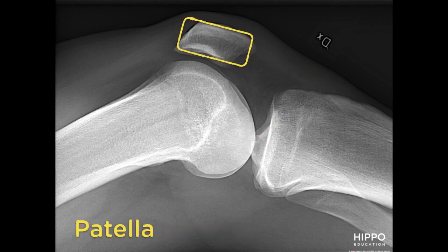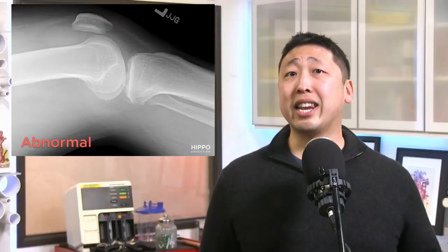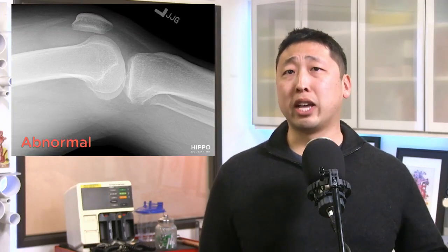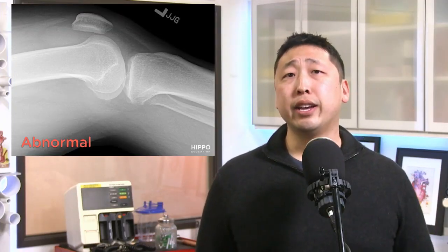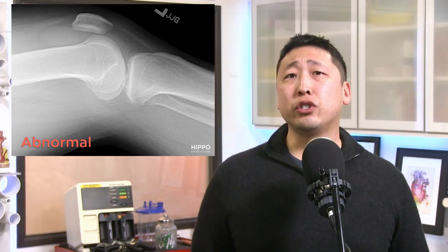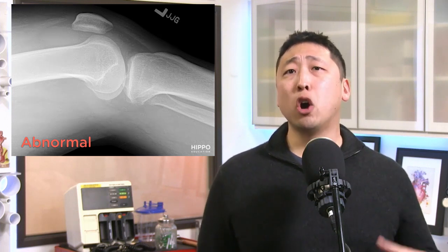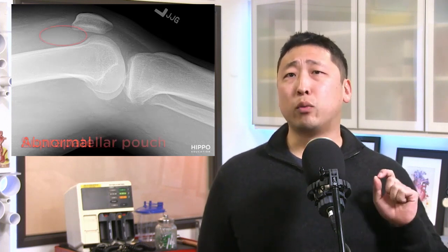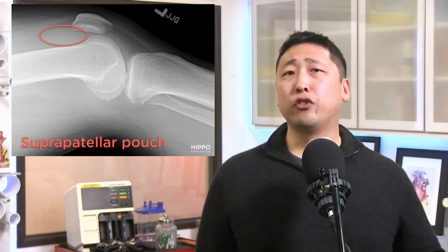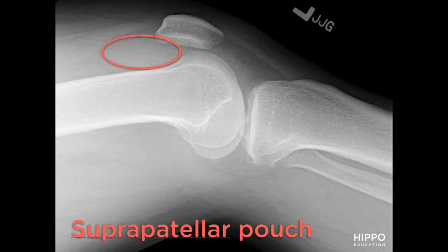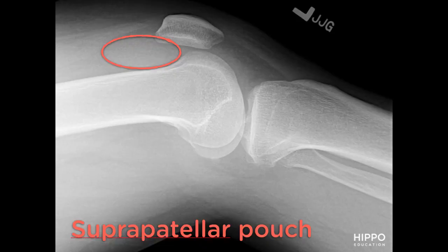Finally, in a normal knee x-ray, the patella is not anteriorly displaced. Now let's look at an abnormal lateral knee x-ray. In knee effusions, you'll often see a homogeneous rounded soft tissue fluid density in the suprapatellar pouch.